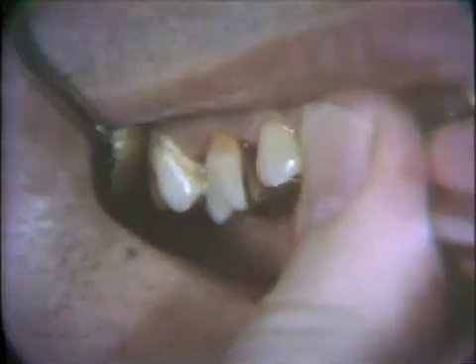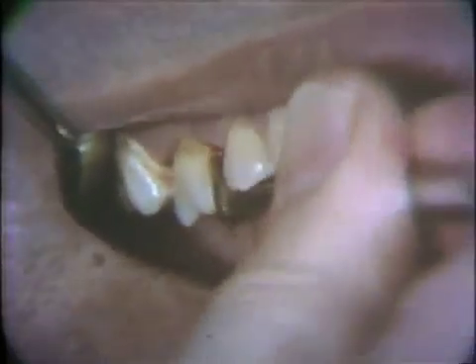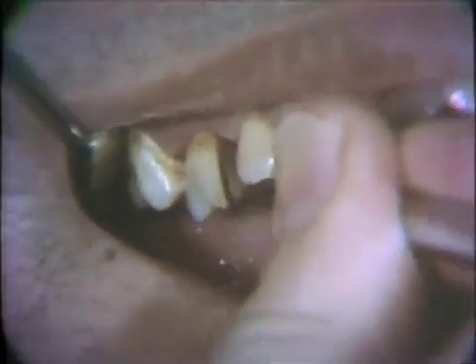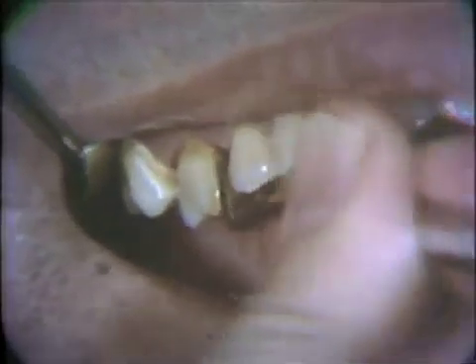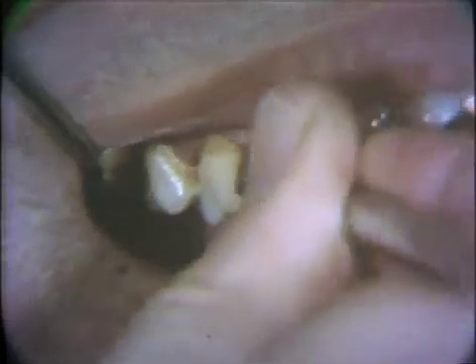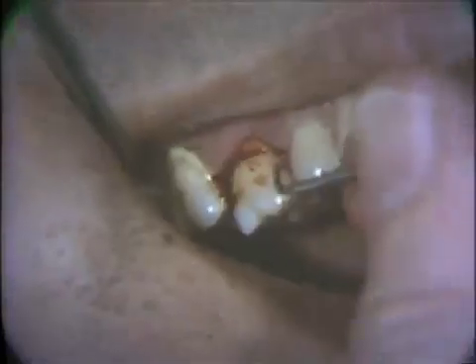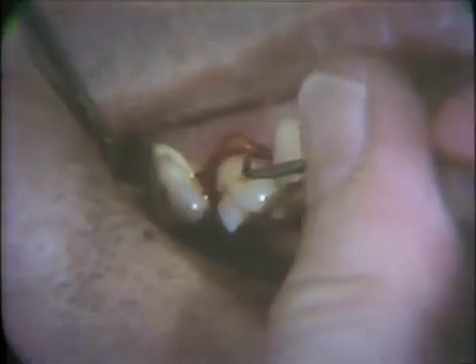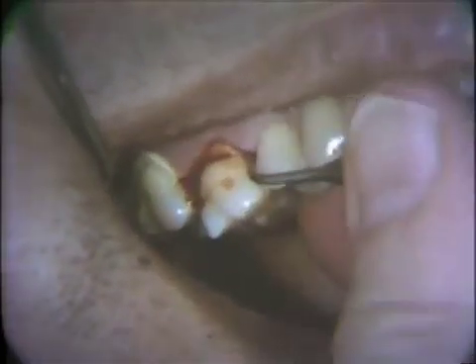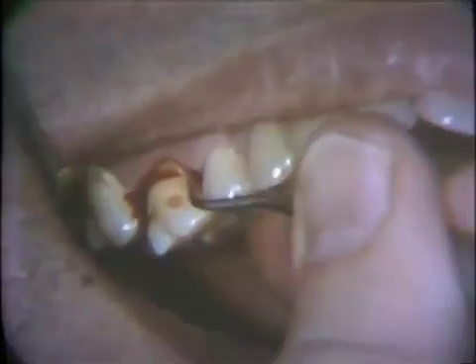Periodontal files are excellent instruments for smoothing the cementoenamel junction and for the initial reduction of gross roughness on the root surfaces. Following the use of periodontal files, the root surfaces should be planed with a curette or a sickle type of scaler.